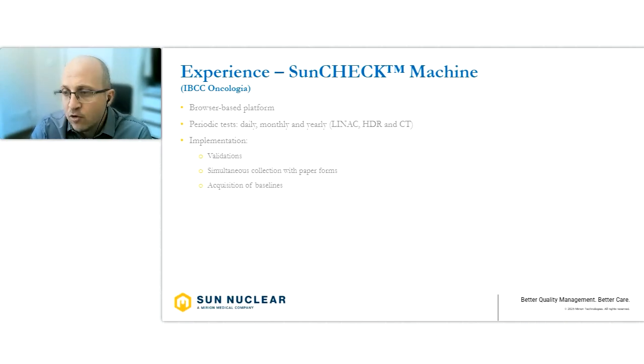I will talk about our experience in the validation and implementation phase of SunCHECK Machine. It's interesting because it's a browser-based platform, and nowadays it allows us to use it for periodic tests, daily, monthly, and yearly, for all of the machines: LINAC, HDR, and CT.